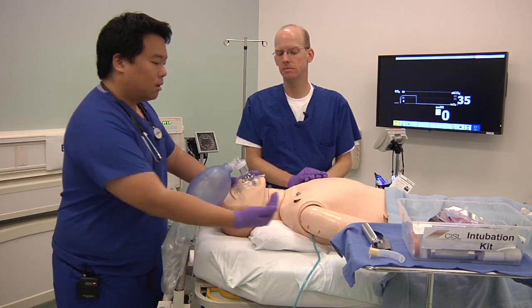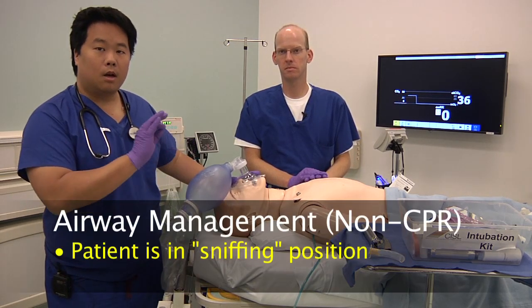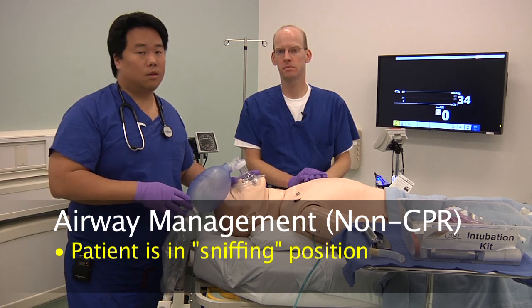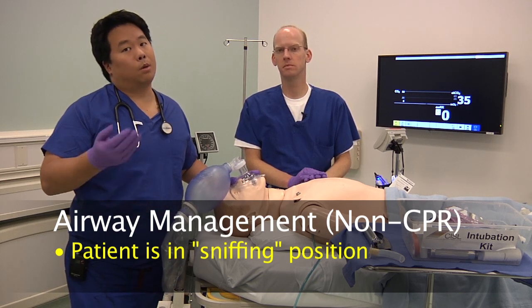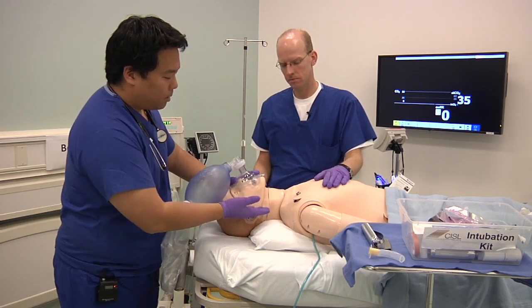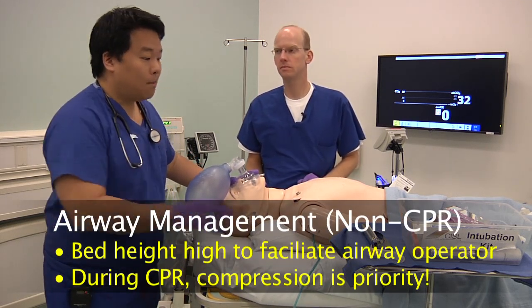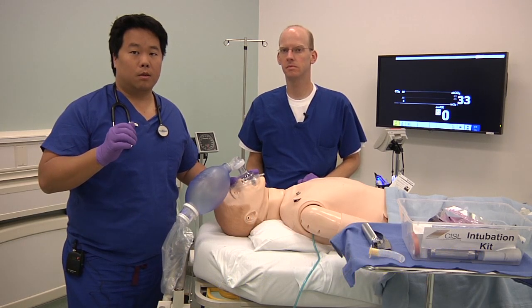The other thing is you'll notice that the patient is positioned much more towards the head of the bed in this non-arrest situation, which you might find, an elective intubation in the ICU, for instance, is one of these situations where the patient is not in arrest, is hemodynamically stable, but requires intubation for some reason. Also, you'll notice that the patient is in a sniffing position, the flexion and extension of the neck to facilitate endotracheal intubation.